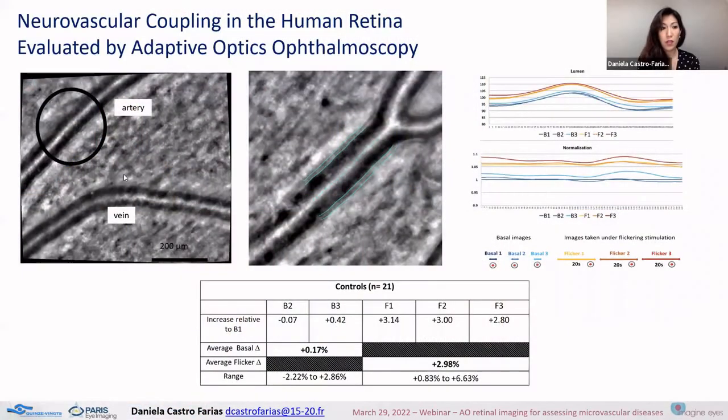Thank you very much, Antonio, for these explanations about what you observed in hypertensive patients via their retina. And now I want to ask Daniela, how did you use AO imaging to explore retinal function, as you said earlier? With the possibility of studying the arteries and the veins, and with the detail of the walls.